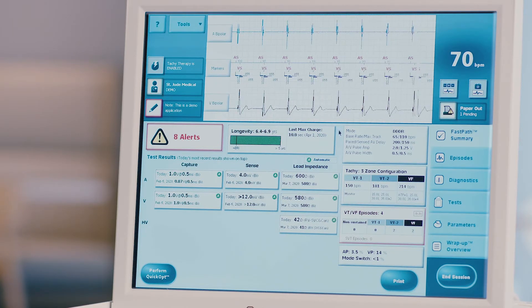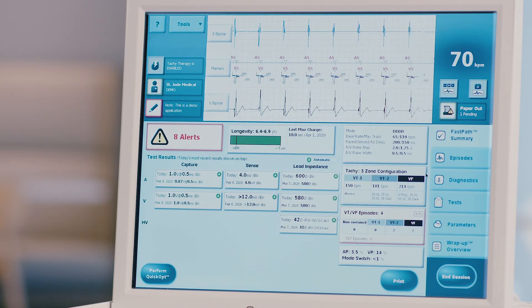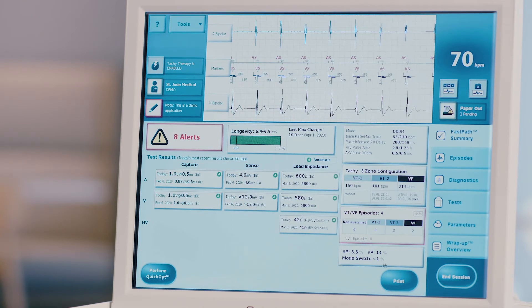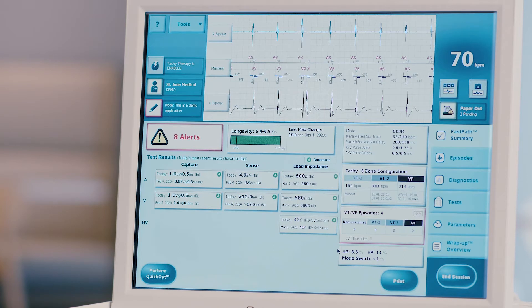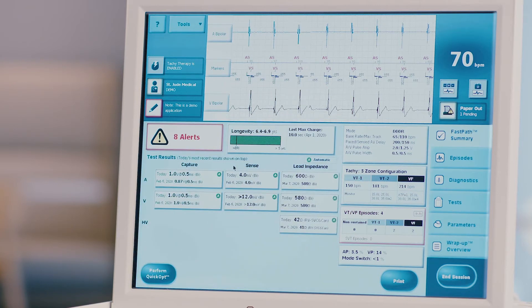Assess the programmed pacing parameters, including mode, base rate, and programmed pacing outputs. Assess the programmed tachycardia therapy zones and treatments. Assess the VT/VF episode overview. Assess pacing percentages and AMS or auto mode switch percentages and episode counts. Assess alerts, if any, by clicking on the red alerts box on the left-hand side of the screen.